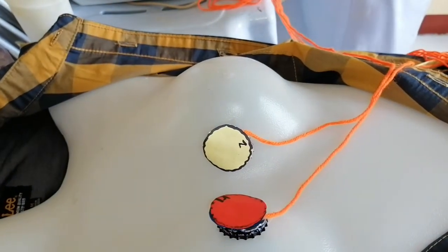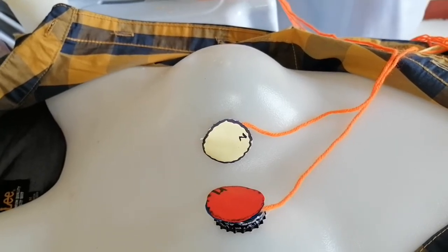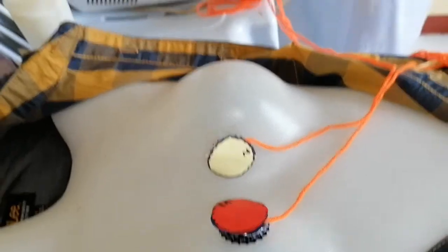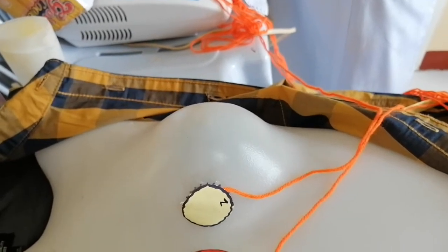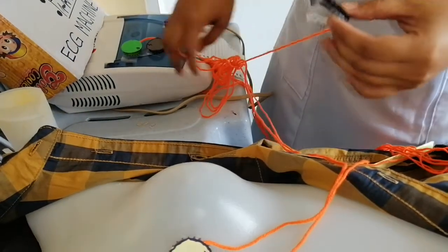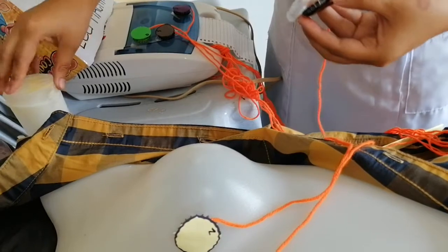Next to be placed is the V4. So before placing the V3, we need to place first the V4, because to identify the location of the V3, it is very easy for us to identify the location if we place the V4 first. So apply electrogel.